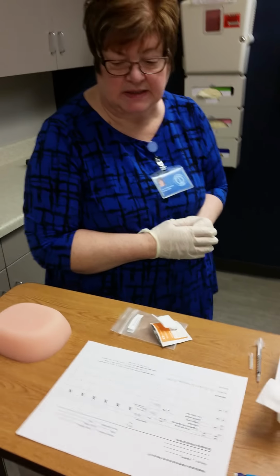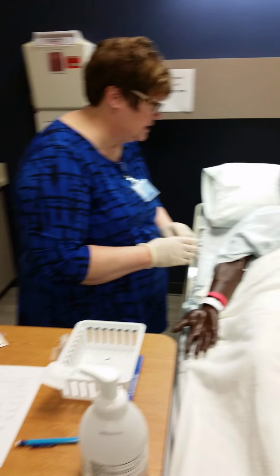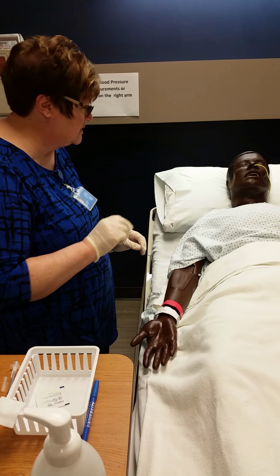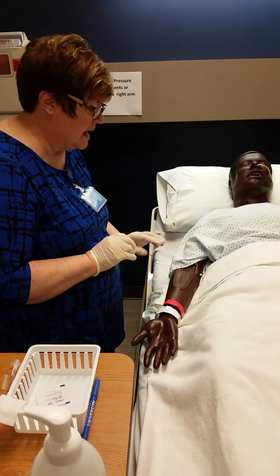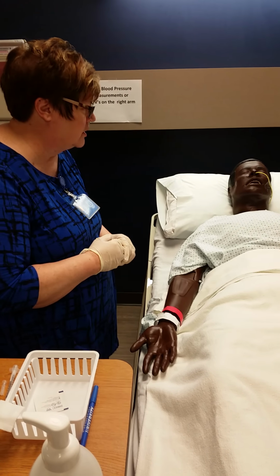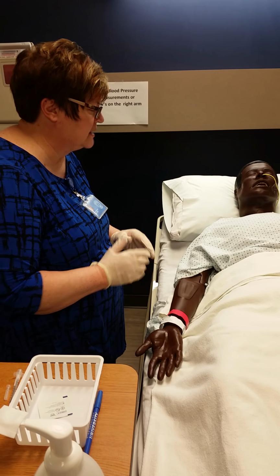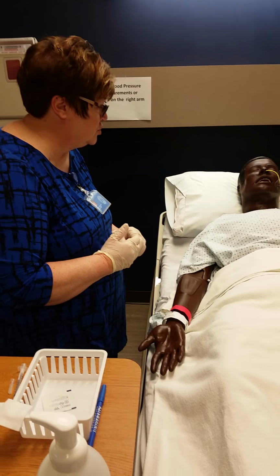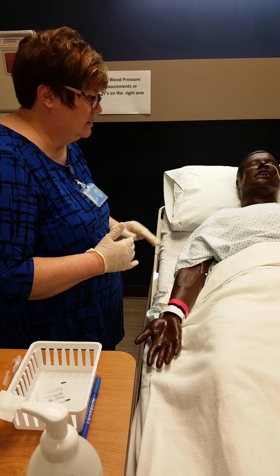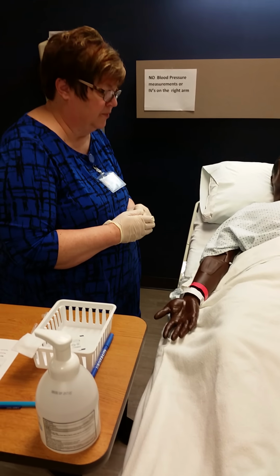Again, you're going to talk to Casey then and tell them, Casey, now on this, where we got this little wheal, this little mosquito bite, I'm going to mark that area with the marking pen, 4 dots, so the next nurse knows where to look for it. And then again, I remind you to come back in 48 to 72 hours. And I'll give you a little card to remind you of that. And then we're just going to come in. It'll take just a few moments. We'll just check it to make sure that there's no reaction to it, and then you'll be all set. Okay? Do you have any questions at all, Casey? Nope. I'll just come back to have somebody look at that in 48 to 72 hours.